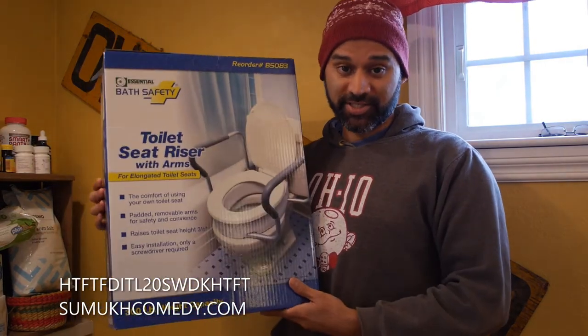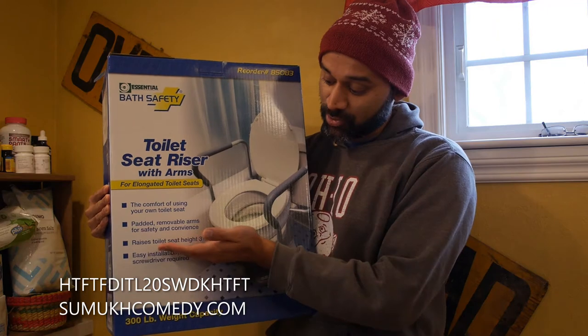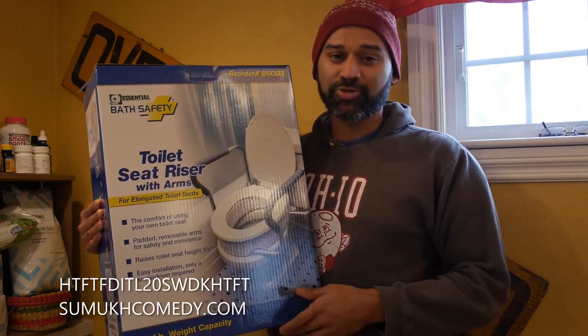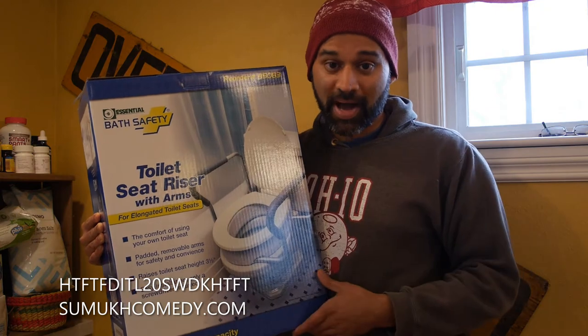And that's the situation I find myself in, which is why I ordered this. As this toilet seat riser says, it raises the toilet seat a height of three and a half inches, and so that will allow the bathroom experience of this individual to be far more comfortable as they let go of their bodily fluids.